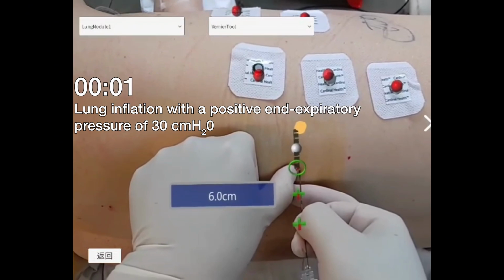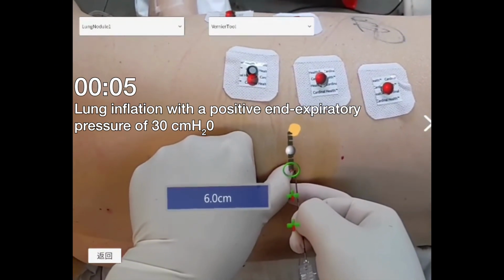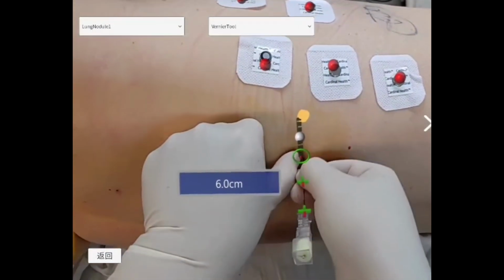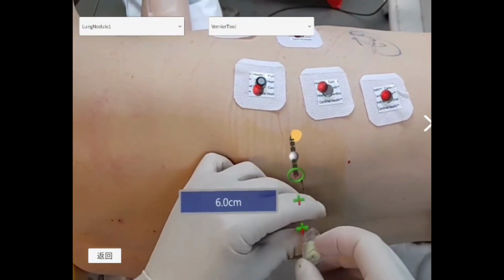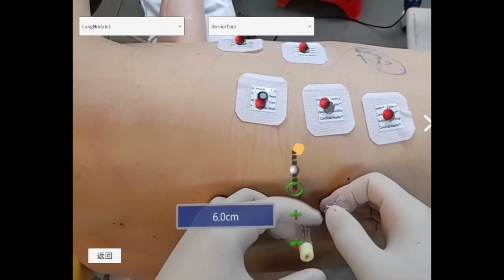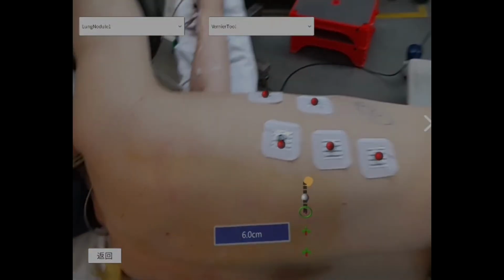Before puncture, ask the anesthesiologist to inflate the lung to 30 centimeters of water pressure and maintain it for 10 seconds. Once the lung inflation is completed and stable, perform the puncture immediately under the guidance of the virtual path. After completing the puncture, remove the augmented reality headset and immediately proceed with surgical skin preparation.